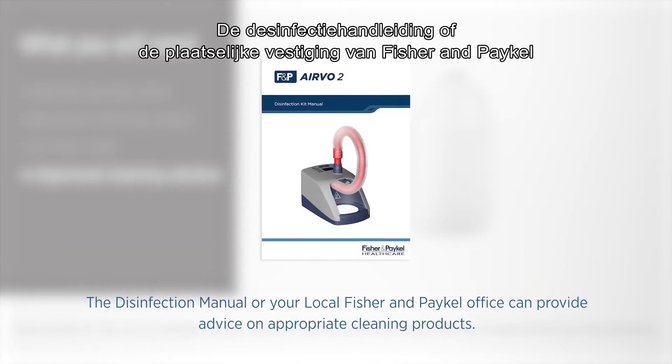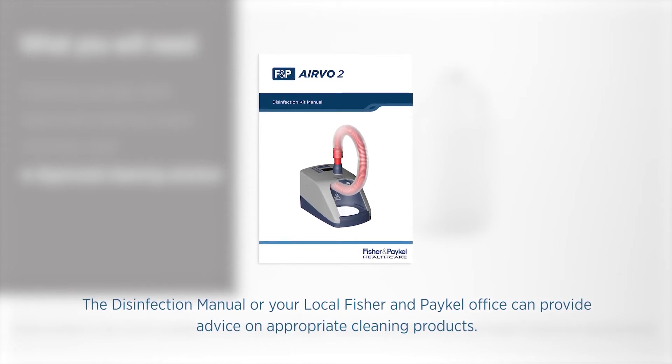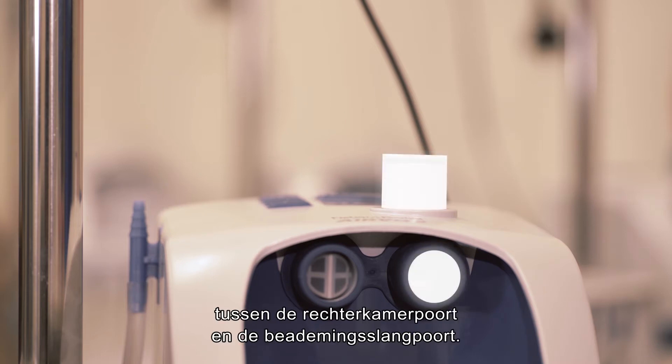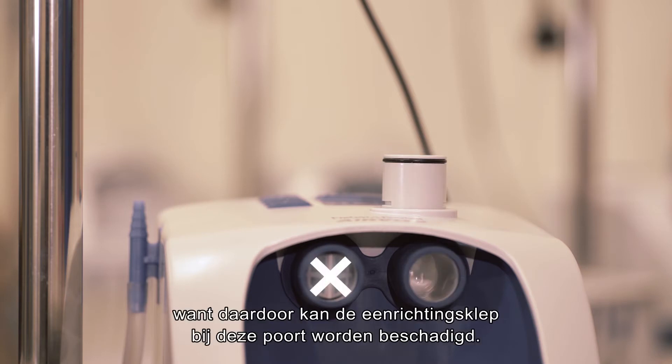The disinfection manual or your local Fisher & Paykel office can provide advice on appropriate cleaning products. The most important part to clean is the outlet elbow between the right chamber port and breathing tube port. Do not clean the left-hand chamber port as this can damage the non-return valve located at this port.